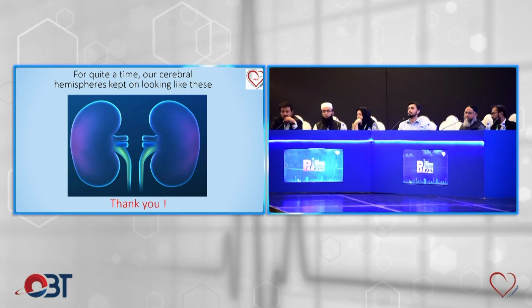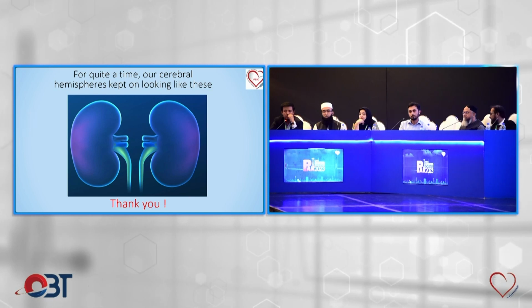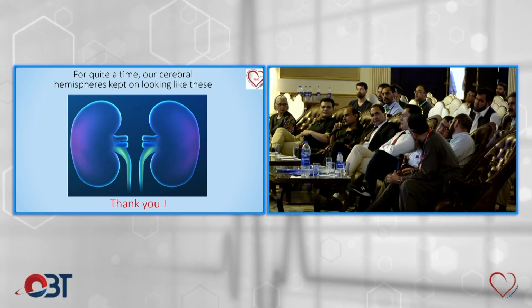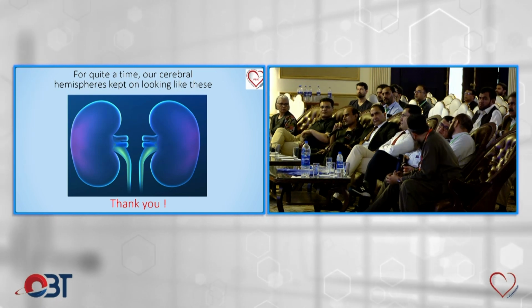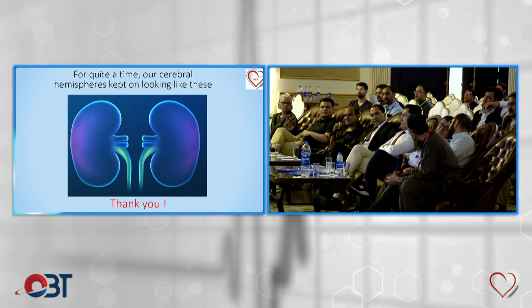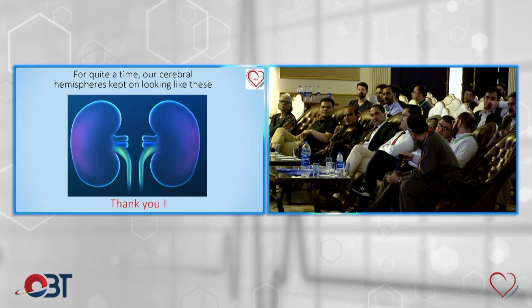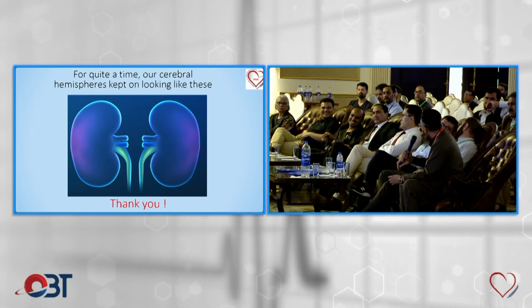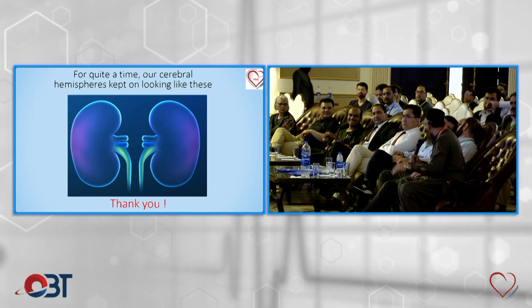So we did not attach the contrast syringe to the manifold at all till the last view, and that was the way we did not give any contrast. Whether the guide is 6 or 7, we did not have the ammunition to fire. I think it was a nice case, of course, an excellent case.